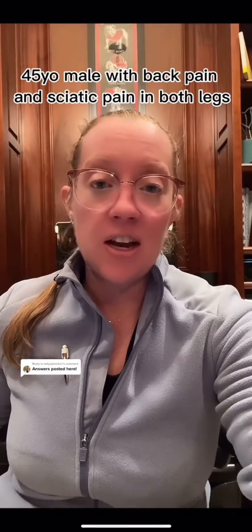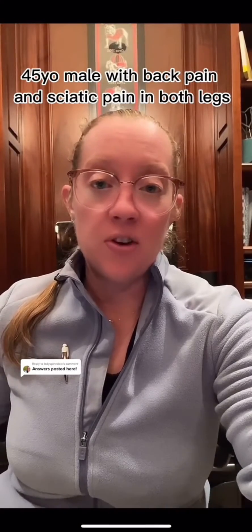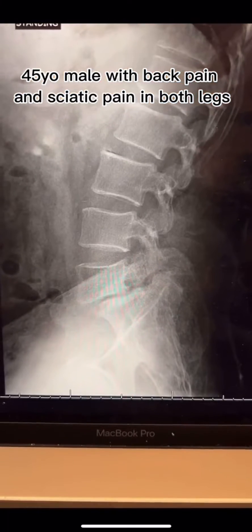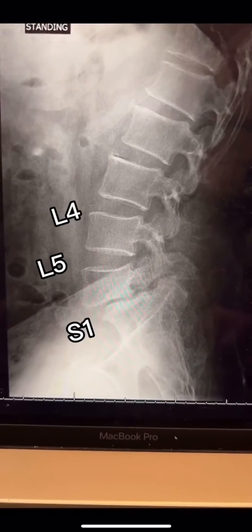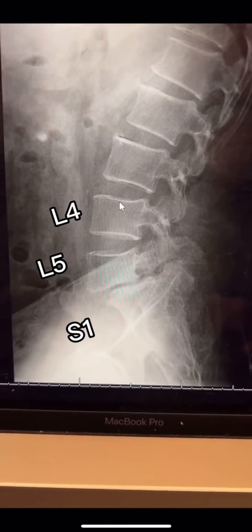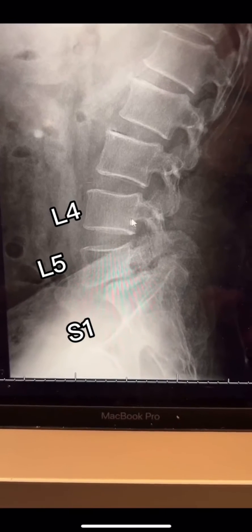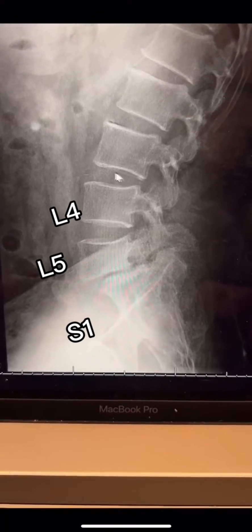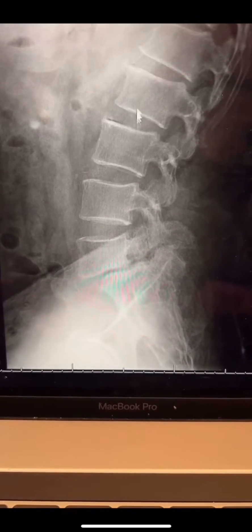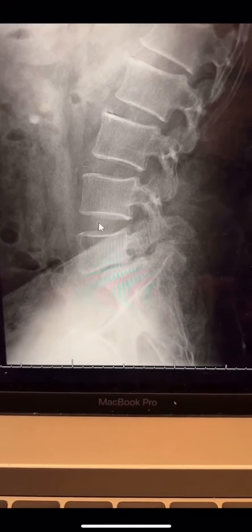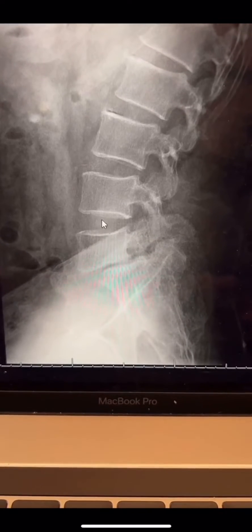Thank you. I'm going to go through the answers to the case study of the 45-year-old male with back pain. Looking at these x-rays, I want to point out these are the vertebral bodies — the bones in our spine — and these spaces here are the discs. Here, that's a normal disc.